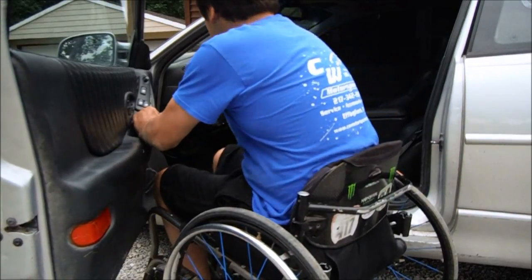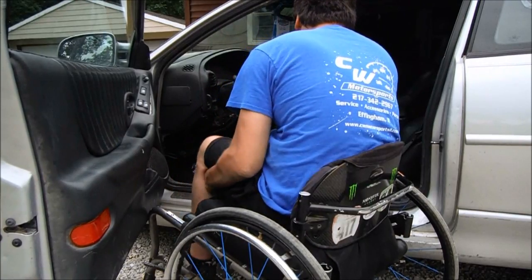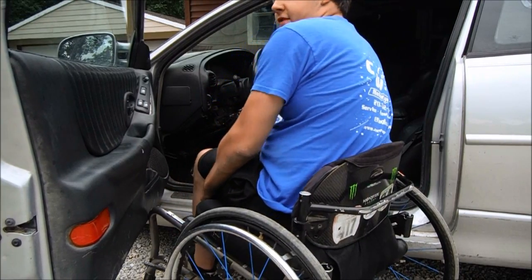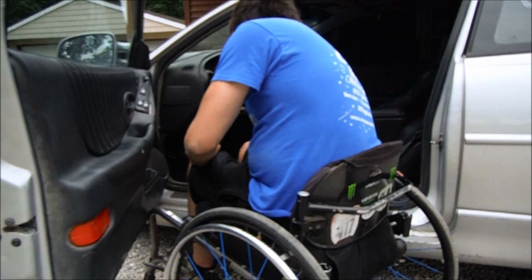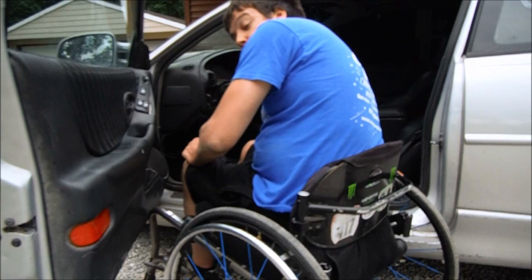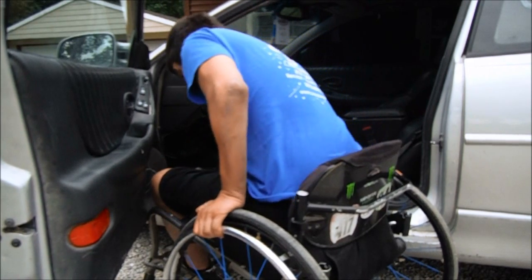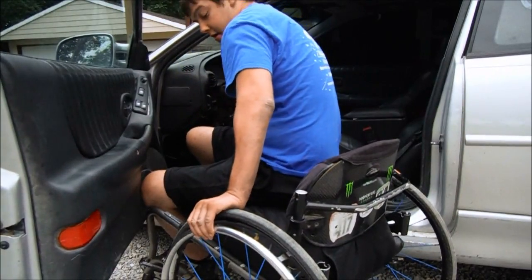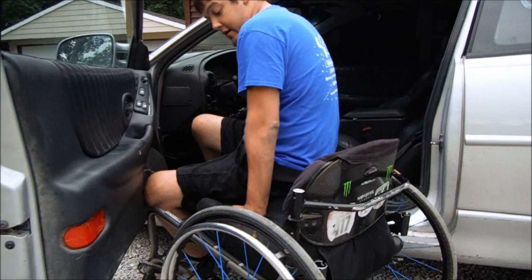I recommend locking the brakes — I don't usually unless I'm on an uneven surface. But if you can see, I throw my right leg up in the floorboard, get my right hand planted on the edge of the seat, kind of scoot to the edge, and get my left hand planted where I know it's not going to go away.